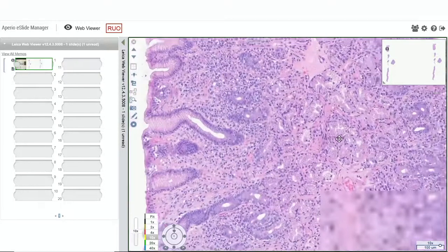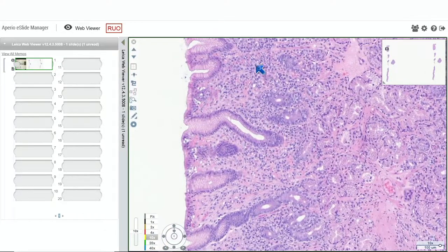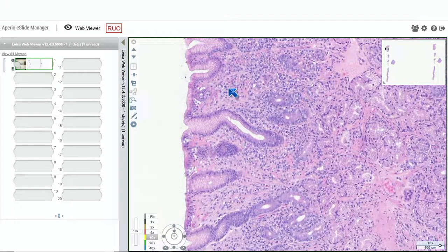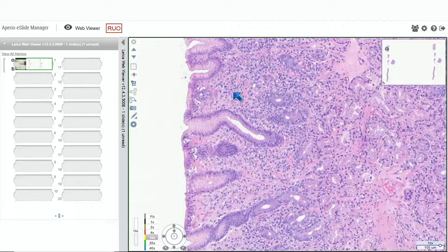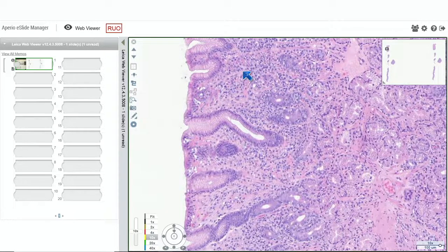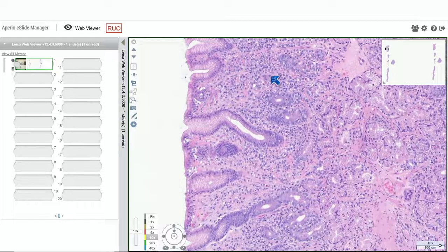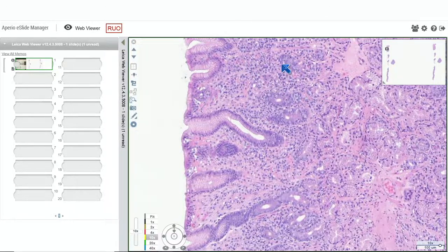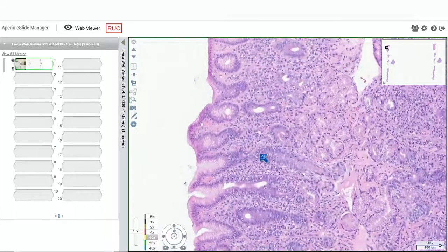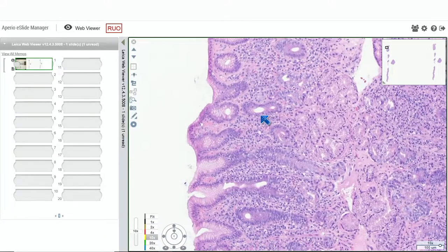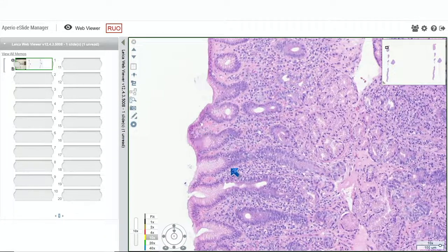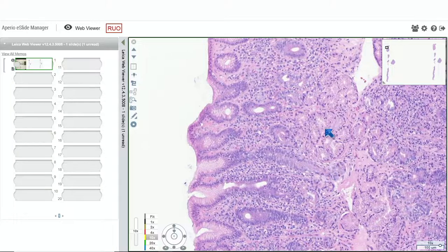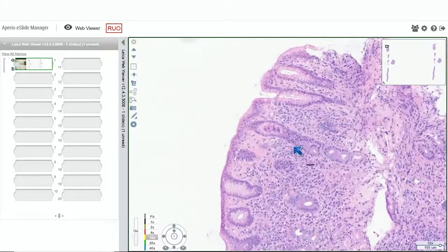When we look a little more carefully, that infiltrate is mostly plasma cell rich. We have a plasma cell predominant inflammatory infiltrate expanding the spaces between the pits and the glands and the deeper mucosa. Overall though, most of this inflammation is more superficially oriented under the foveolar epithelium with relative sparing of the deeper glands.